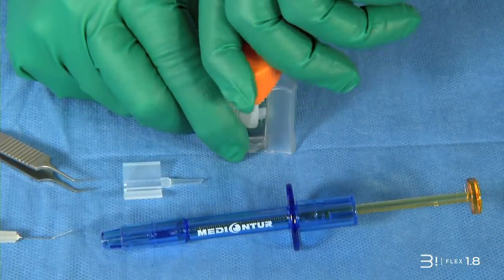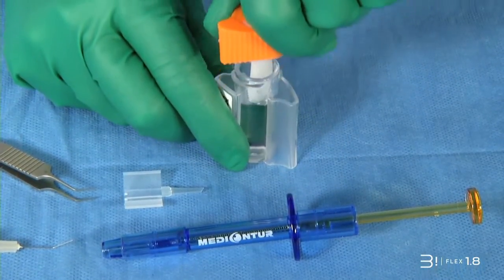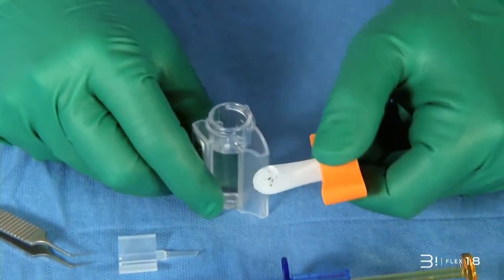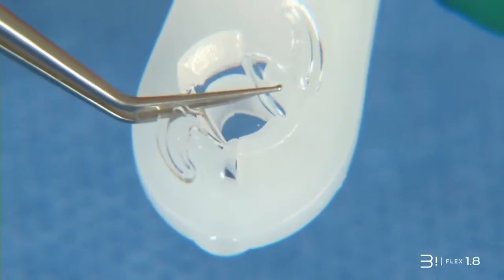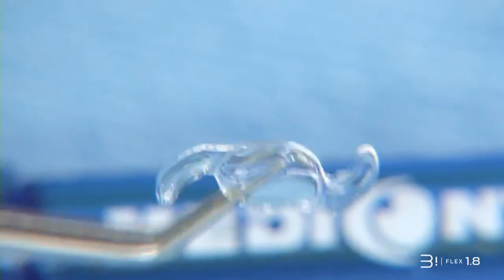Unscrew the stopper of the flask. Carefully extract the top shaft supporting the implant. Delicately seize the Biflex implant so as to preserve optic quality.